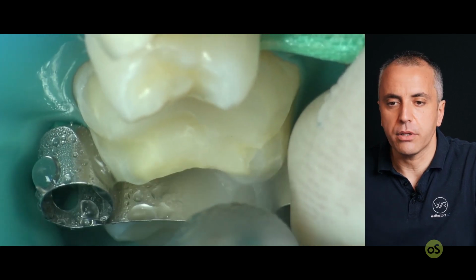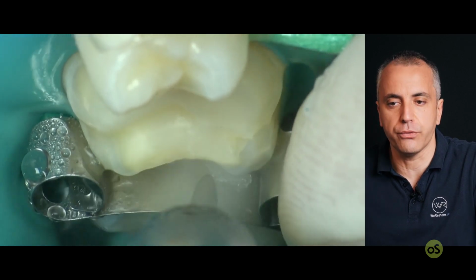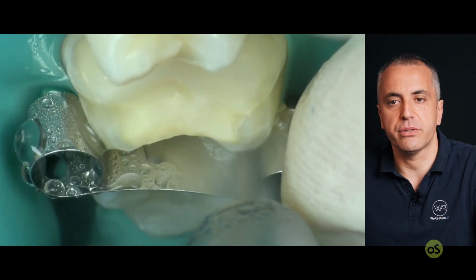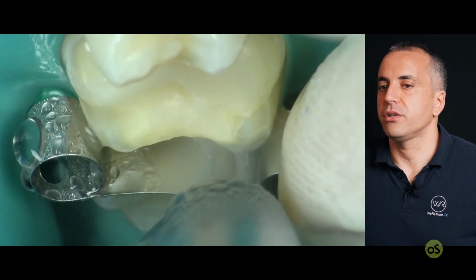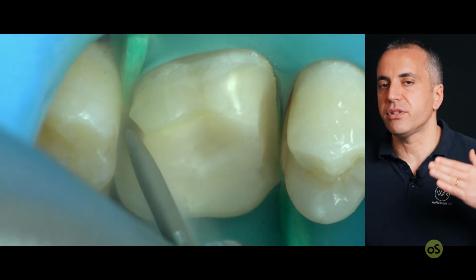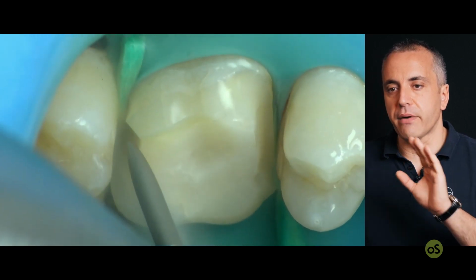So the preparation is almost finished. We just need to finish the connections and finish and polish all the restoration. Of course, it works even if the restoration is not completely smooth, but the impression and also the cementation procedures work smoothly if the margins are very, very smooth.